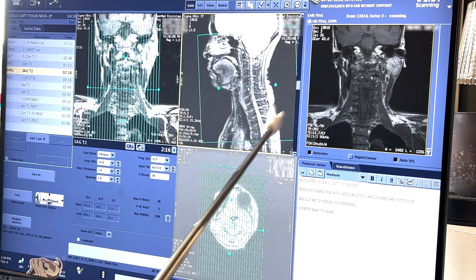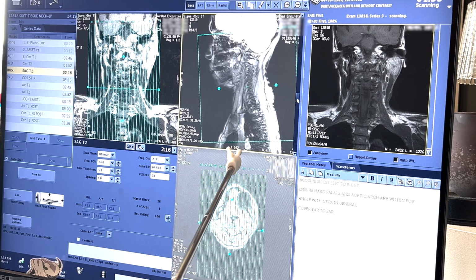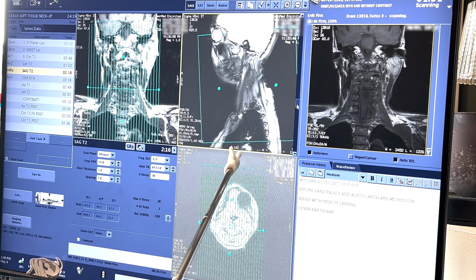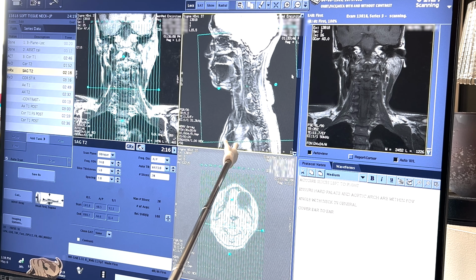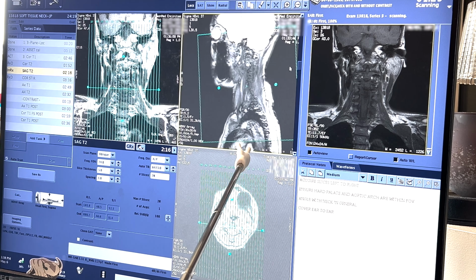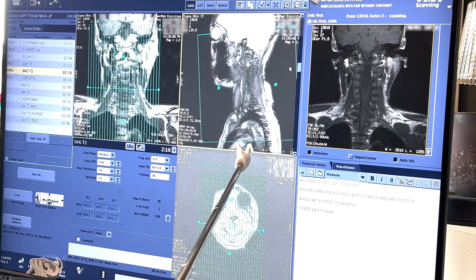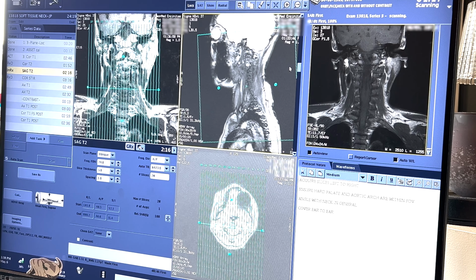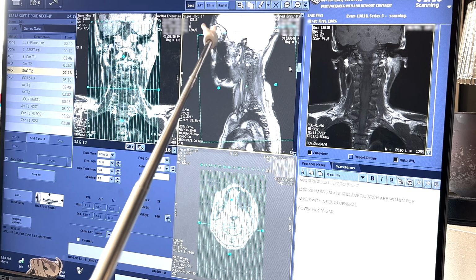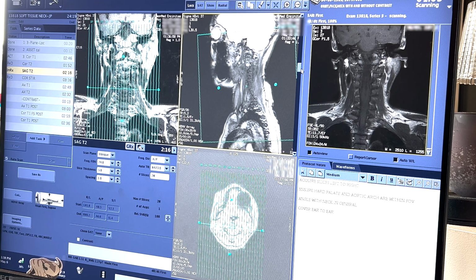Perfect. So if you scroll, we could probably find the aortic arch right in here somewhere. There we go. Oh, never mind. Those are lungs. Keep going back. Other way. Keep going. Oh, right in there. There it is. So typically, like I said, at our site, we'd cover from here to the hard palate, not visualized. But in this case, we're evaluating parotid tumors, so we're going to stick to typical coverage, which is orbits down to manubrium. So let's scroll back to midline.